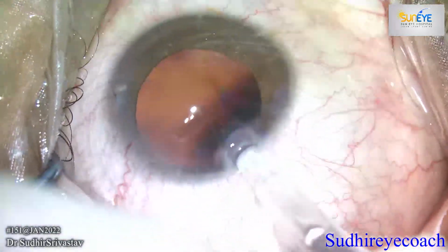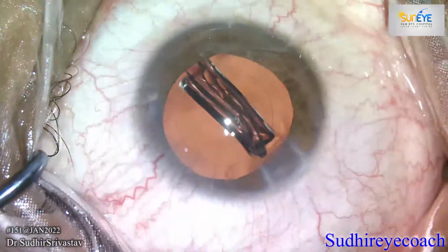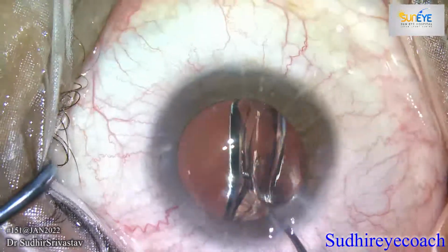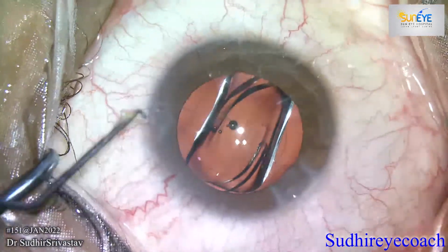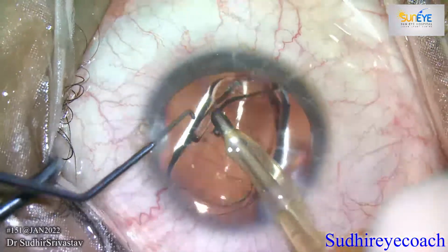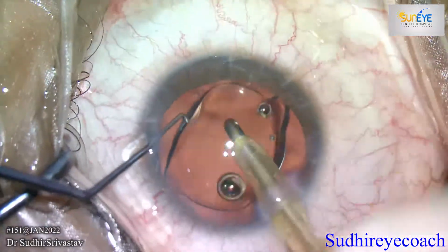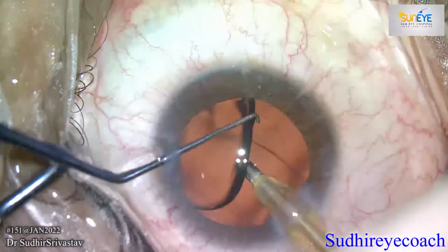I cleared the epinuclear plate and implanted the single piece hydrophobic implant in the bag. And before closing, always check if any incision is gaping. If there is gaping, then you can place a suture here. Luckily there was no breach in the integrity of the corneal incisions.